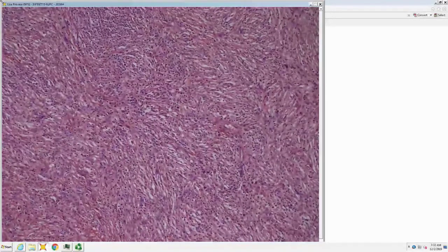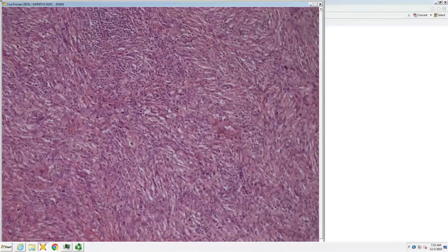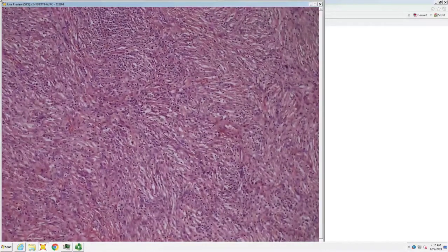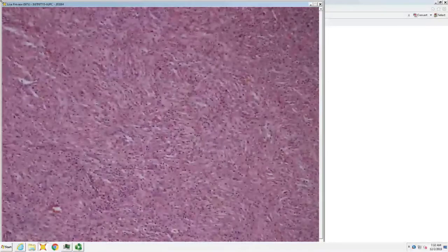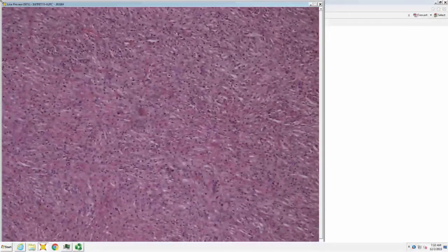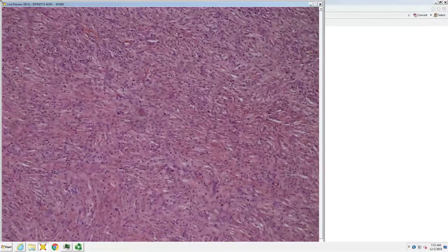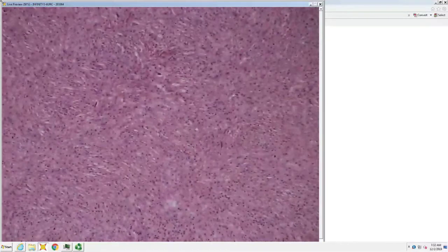Because if they're neutrophils, this could be erythema elevatum diutinum, right? EED lesion, as in a patient with HIV. If they are lymphoid, then you look for virocyte-type cells that look kind of like Reed-Sternberg cells. And that would go with inflammatory myofibroblastic tumor.